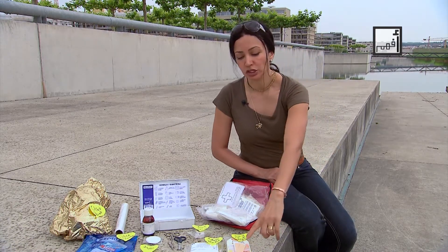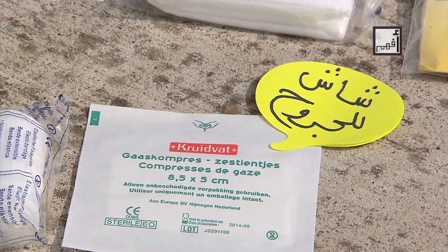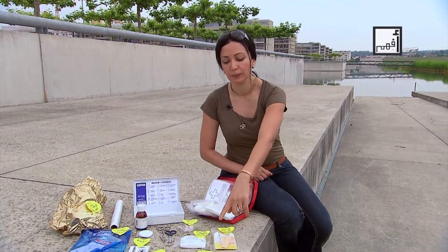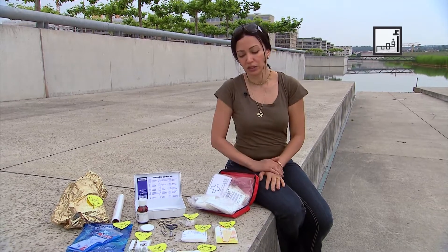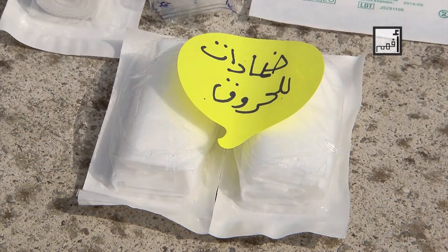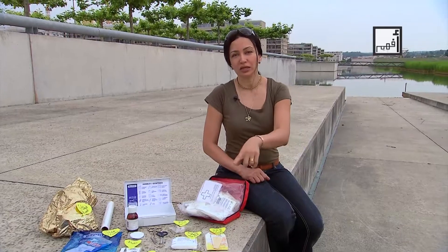There also should be gauze in different sizes. For example, this one is eight and a half by five centimeters. There's also a ten by ten centimeter gauze, and there are bigger sizes available as well. I recommend the medium size, eight and a half by five centimeters, as it can cover larger wounds.